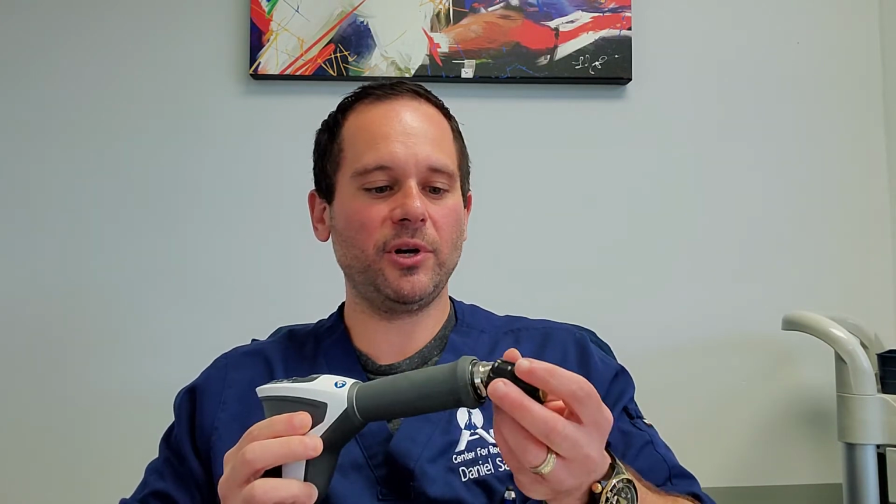For this treatment, there are normally three parts. So the first part, what we would do is we'd find the hand piece that would be proper for the treatment we are performing. So we would just put that on here.